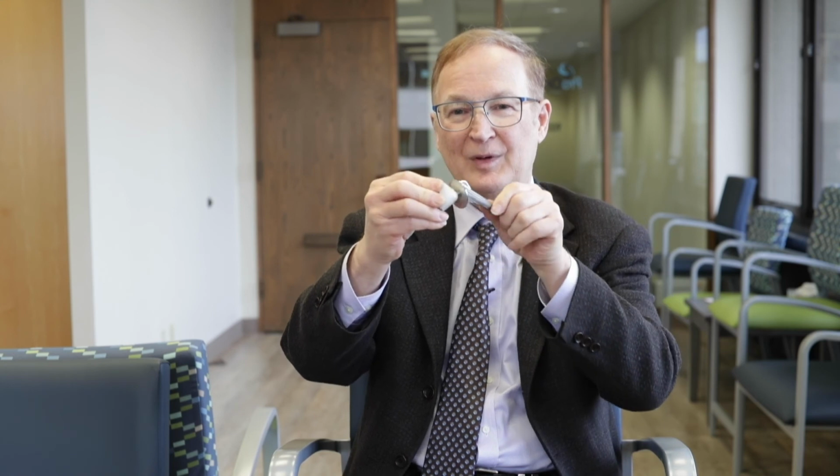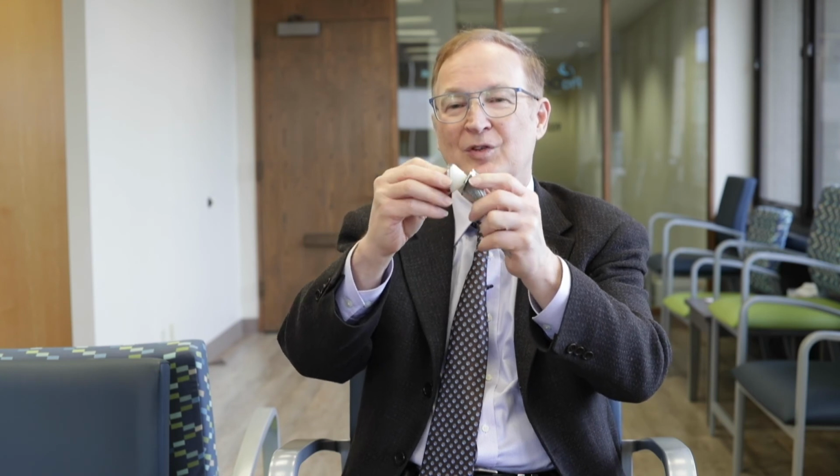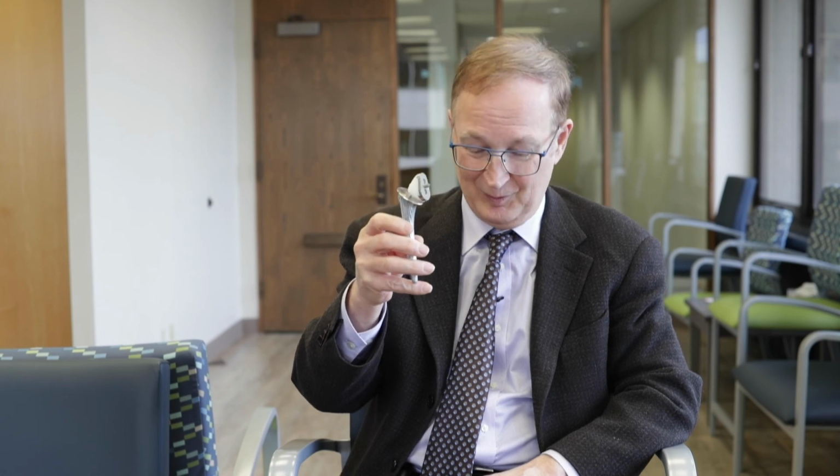inside the patient. This was a dramatically successful and stable shoulder that had a potential for full range of motion, full stability. The trouble was the forces on the bone were too great, and ultimately it failed. This particular implant, this prototype, turned out to be his last operation of his 53-year career. The very last operation that he did, at age 86, was this implant. And this is the prototype of the one he made shortly before implanting that. He was very proud of it and made a gift of it to me. So I have it here for interest.